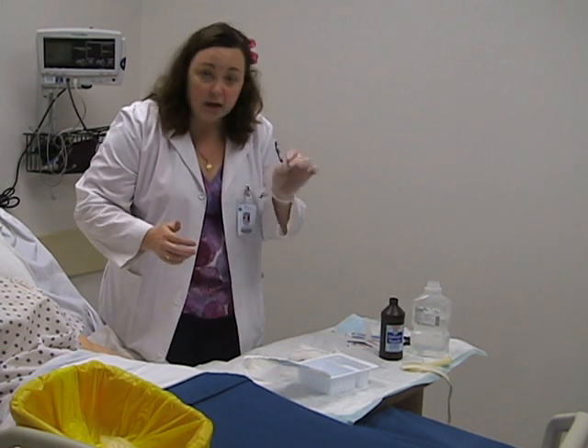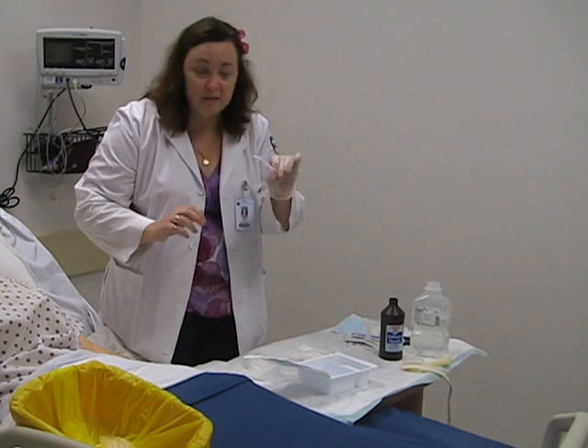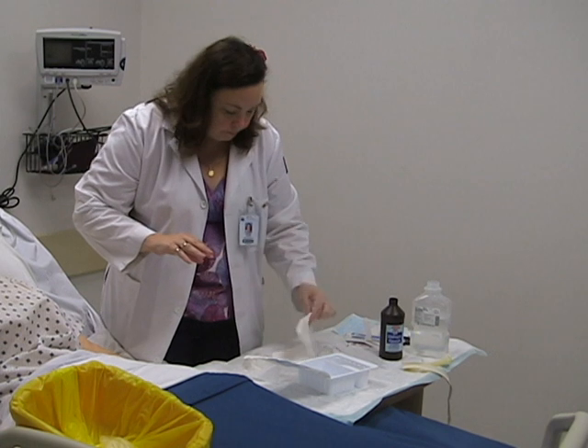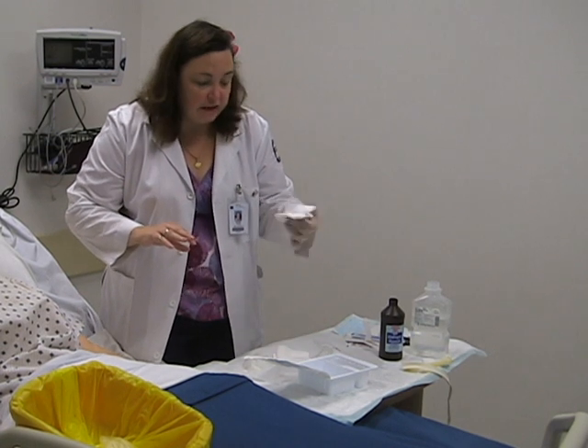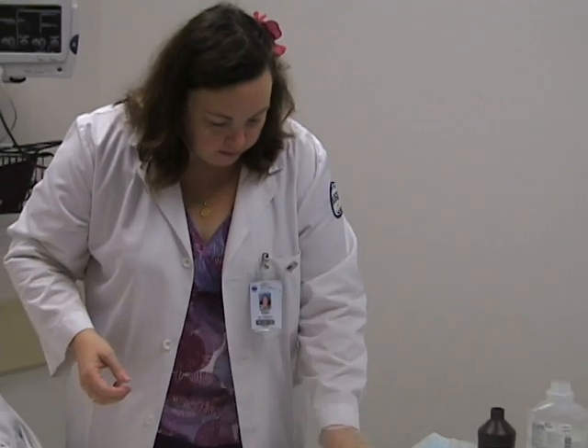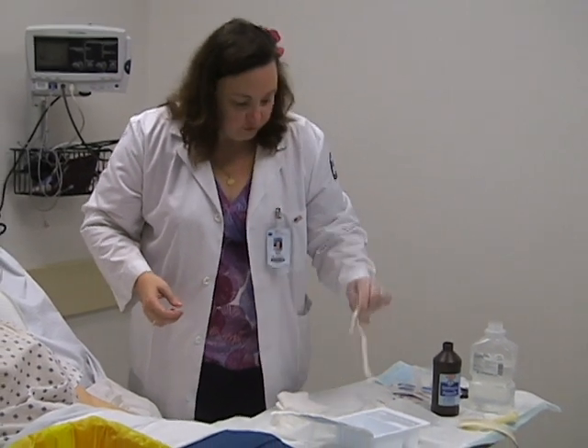Inside the kit there is a little bottle brush, a couple of Q-tips — I like having a couple extra because you never know — some pipe cleaners, and trach sponges. If you look at your trach sponge, it has an already prepared slit on it. Some places will actually cut 4x4s to fit around there, but I don't like to do that because of the risk of little fuzzies or cotton ends getting stuck into the stoma or a patient actually inhaling them — so use the commercially prepared ones if you can. Then I have some extra 4x4 gauze and the trach ties.